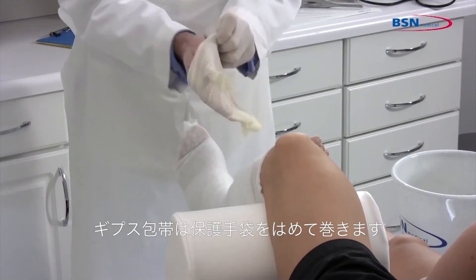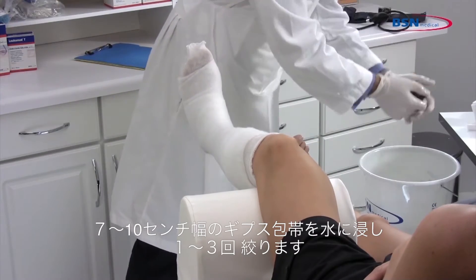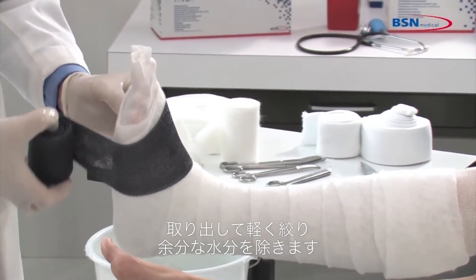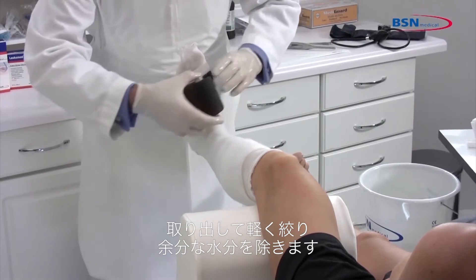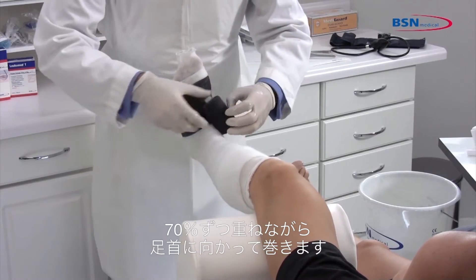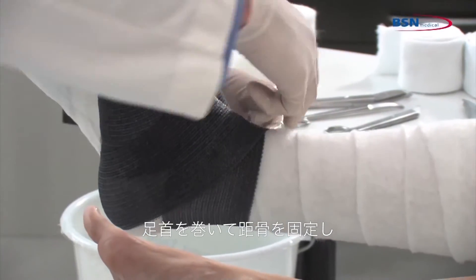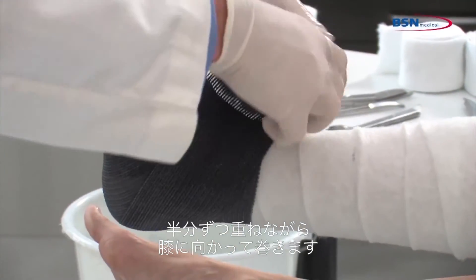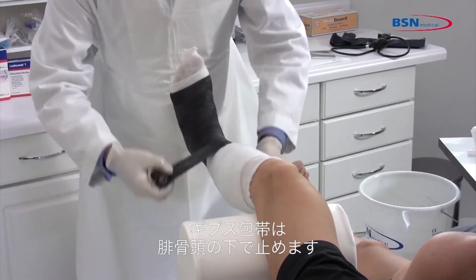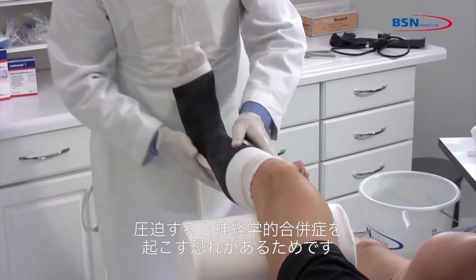Begin by putting on protective gloves before applying the cast tape. Dip 3 inch or 4 inch cast tape in water, squeezing 1 to 3 times. Remove from water and squeeze 1 time to remove excess water. Start wrapping cast tape at the metatarsals twice, working toward the ankle with 70% overlap. Go around the ankle to lock in the talus. Continue with 50% overlap toward the knee. Be sure to keep the cast tape below the fibular head, as pressure on the fibular head could cause neurological complications.